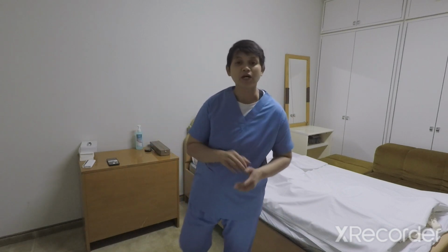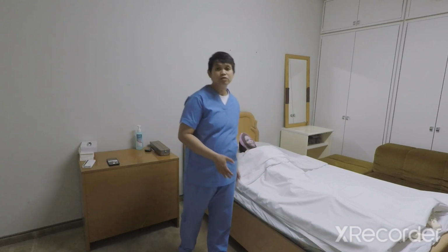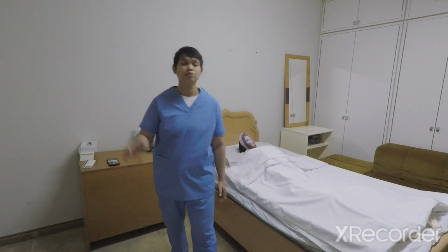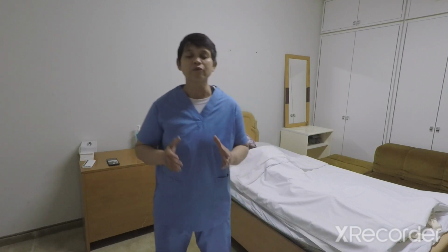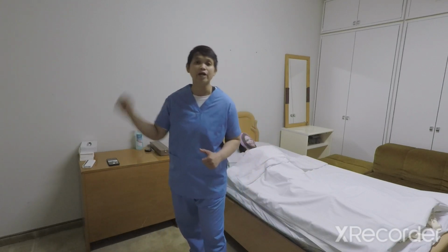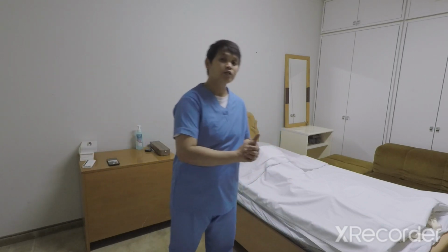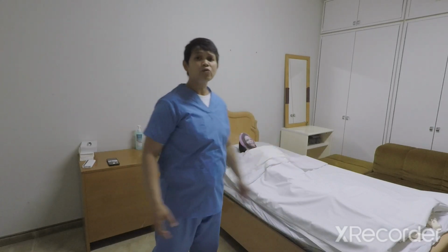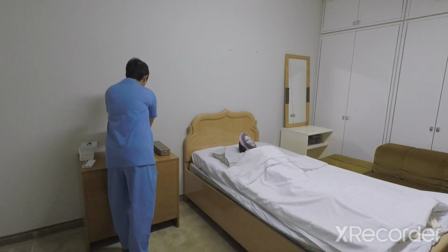Hi everyone, so today I will be demonstrating how to do transfers of a patient from bed to chair and chair to bed. Before we start transferring the patient, first, when we go inside the room, we should knock at the door. Okay? When you are already inside, before we approach the patient, we should do hand hygiene.